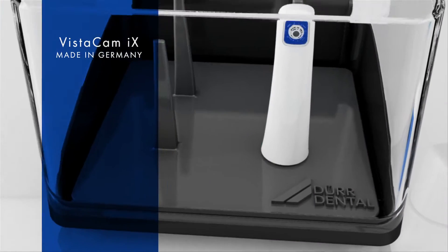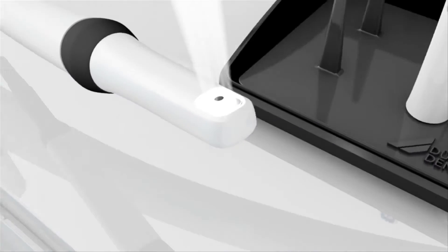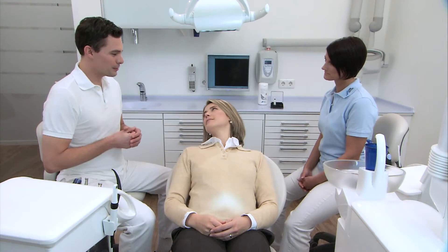Camera systems by Dürr Dental provide valuable help for dental treatment. They enhance the patient's understanding of the treatment that has to be carried out and help the practitioner in making a diagnosis.